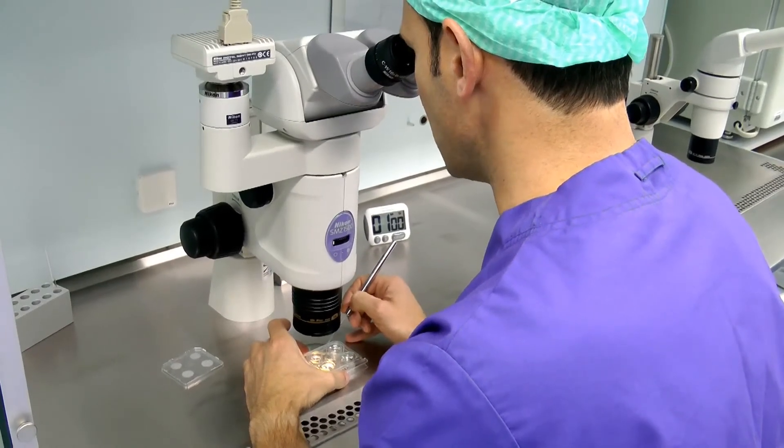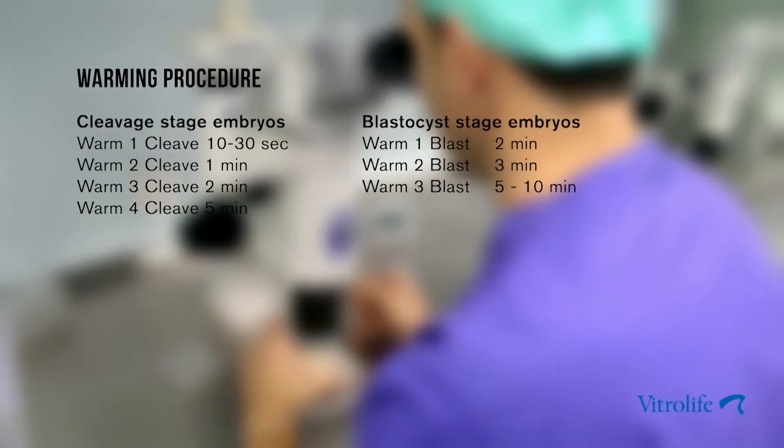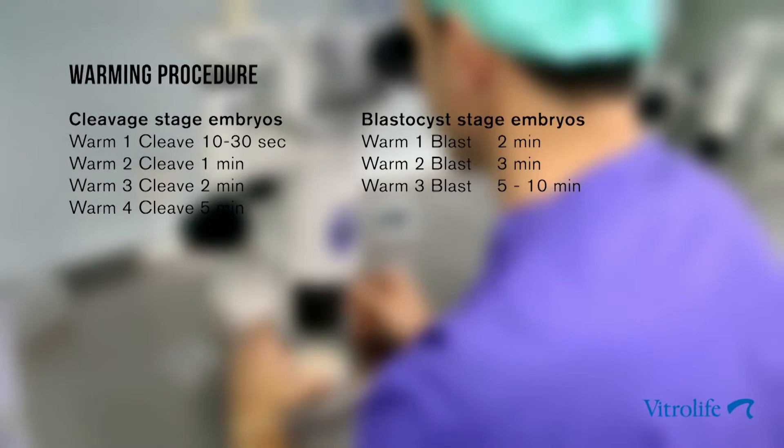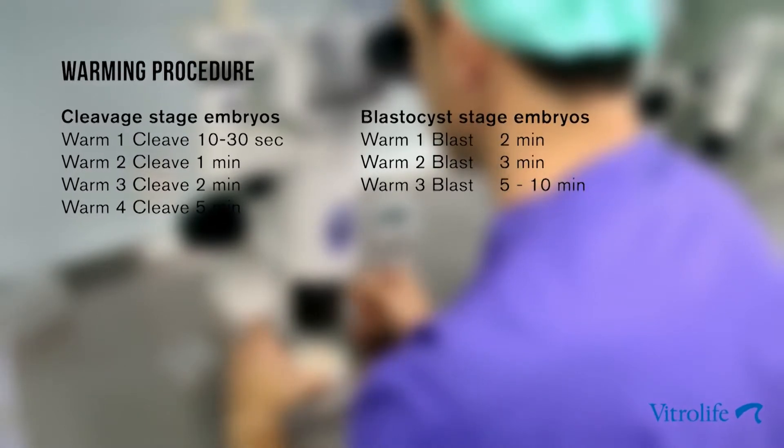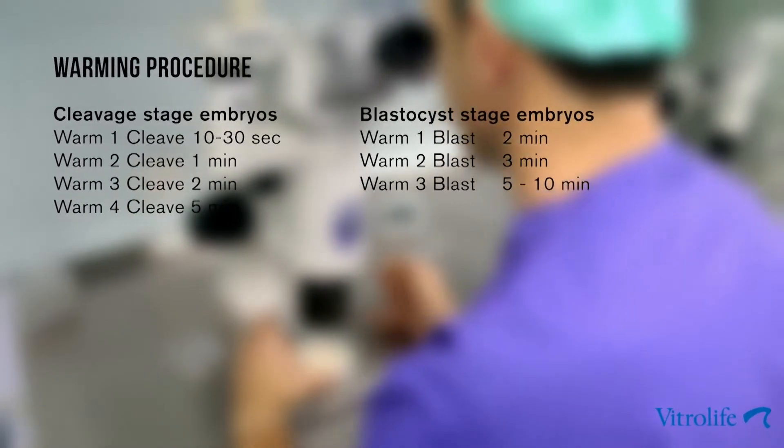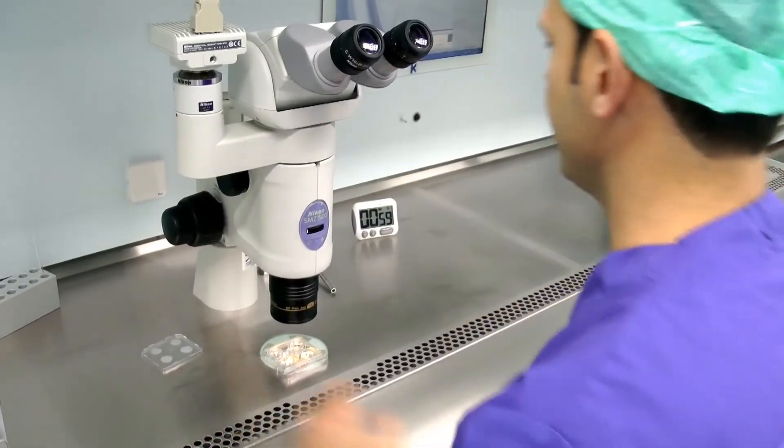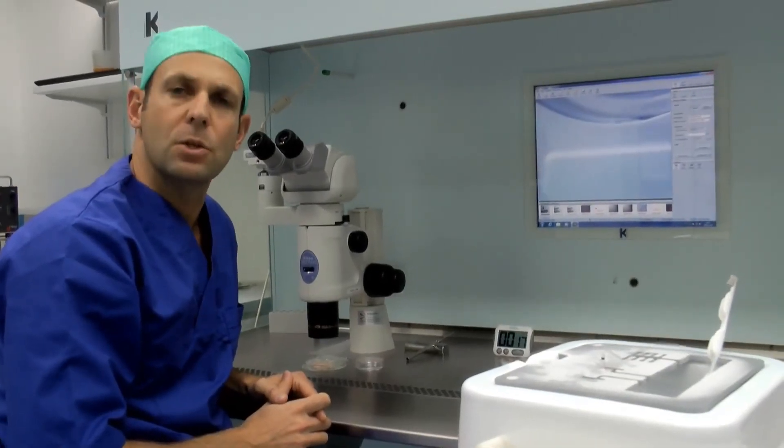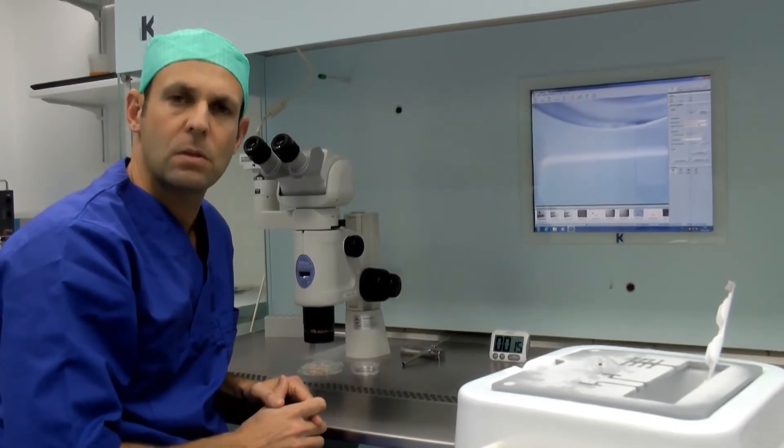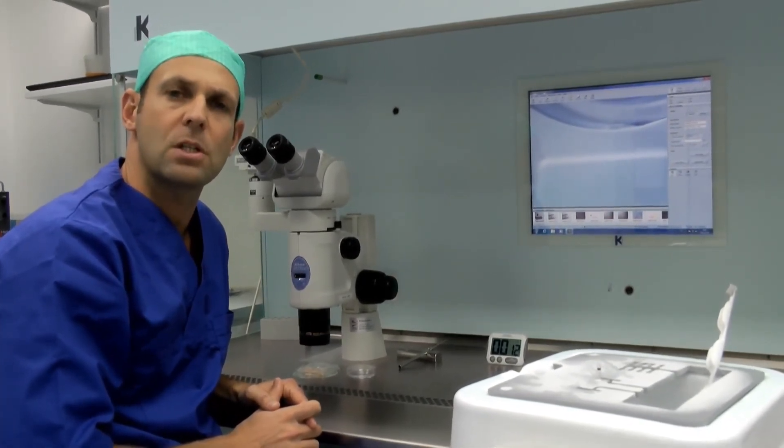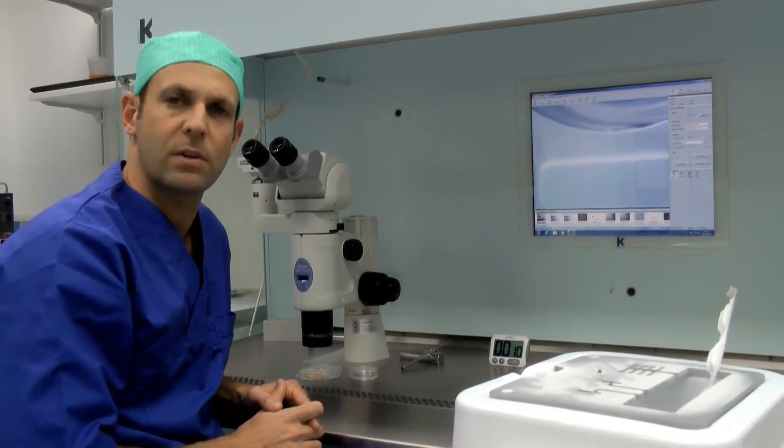Once you have located the embryo, move it through the different warming solutions according to the protocol for either cleavage stage embryos or blastocysts. Once the embryos have reached the last solution, move them into your culture dish, give them a good wash, and move them into the culture dish until the time of embryo transfer.